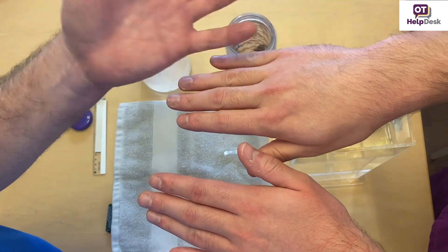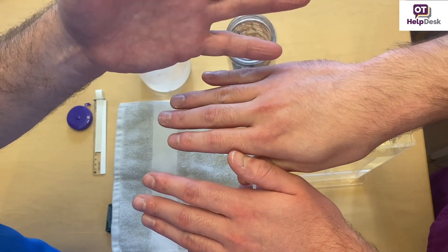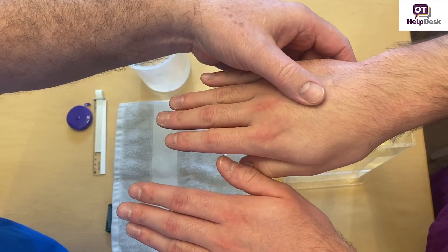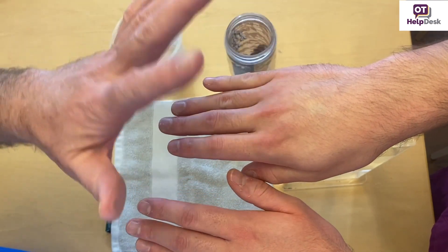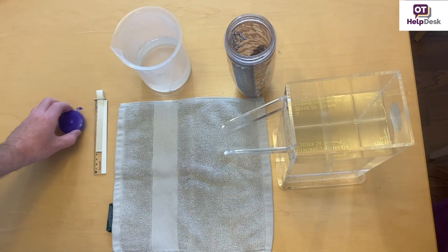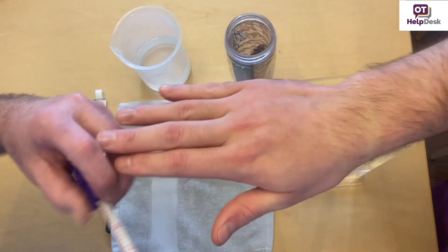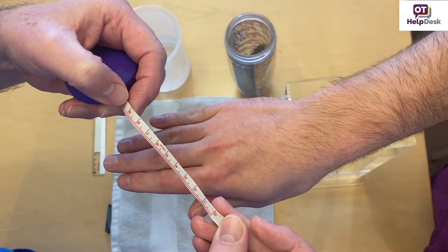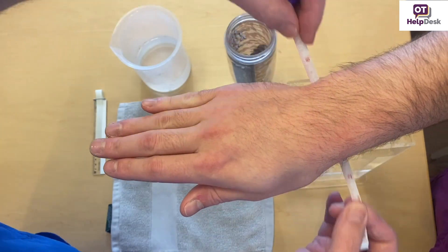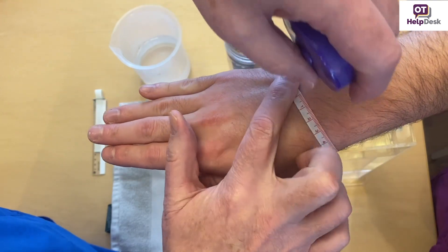Now, what if they're both swollen? Well, you'd have to maneuver your way around that, but let's pretend that one hand is more swollen than the other. So the most important thing that we measure first — Joseph, bring your hand up — is we're going to measure in centimeters. We're going to measure the wrist; you just put it right at the crease, bring it around, and measure. Joseph's wrist right there is 18 centimeters.